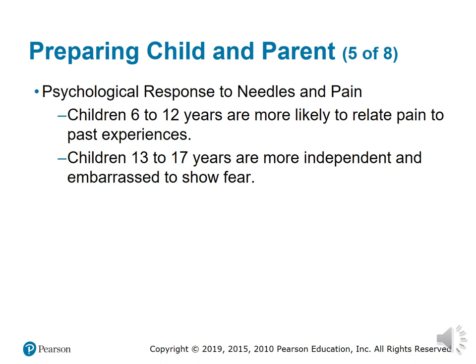So guess what you have to do? You have to have patience and start all over again, because half of the time you've cleaned your spot, put the tourniquet back on, and gotten the needle ready to stick, and they'll stick their hand up there and be like, no, I'm not ready. And you have a dead needle in a dirty spot that you have to disinfect all over again. Make sure you find the vein because they move, they jump. So the vein may not be in the same spot you found it in the first time.